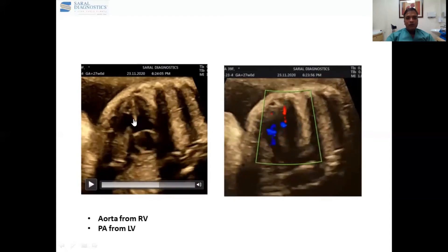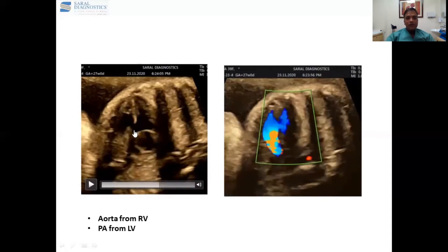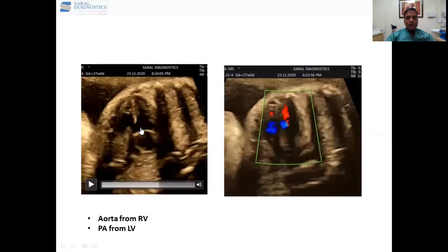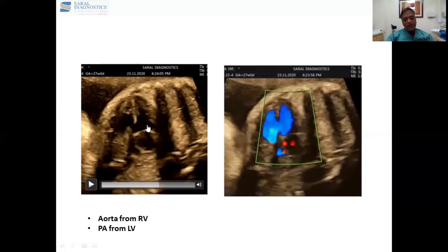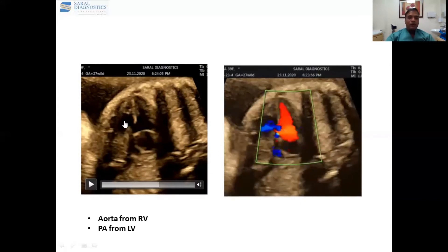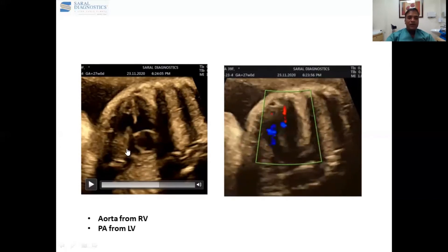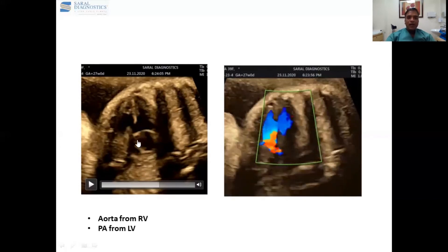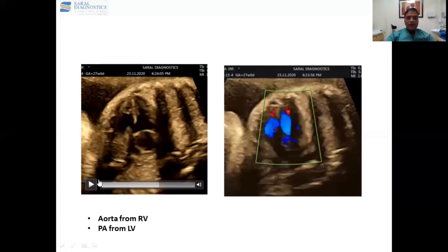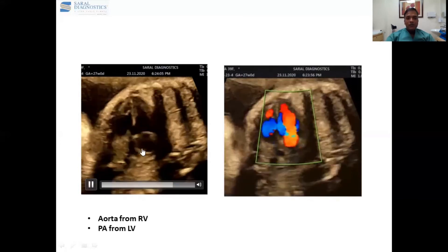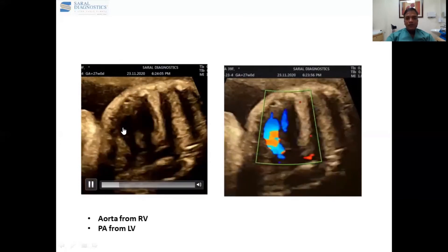This is coming out from above the septum, committed to both the left ventricle and the right ventricle. And there is another vessel that comes out from the right ventricle — this is the aorta.